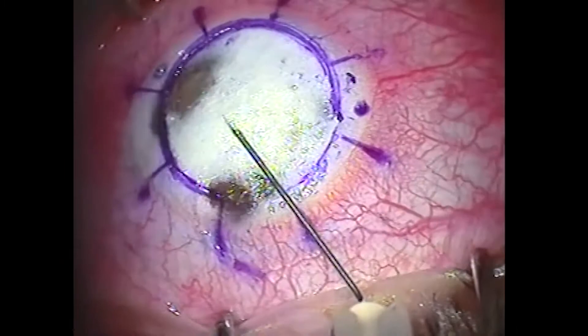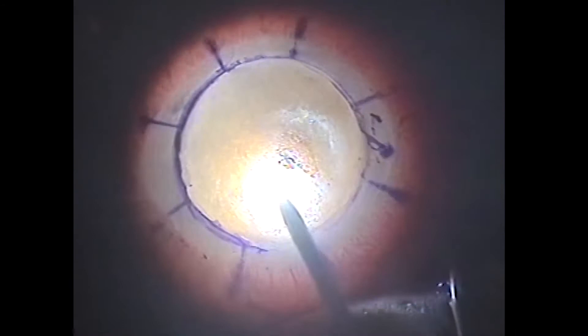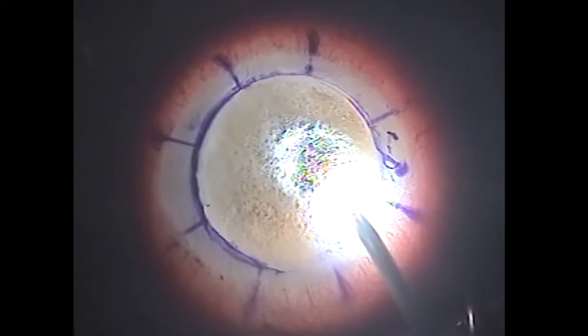Here we can see a small decentered bubble. We proceed to apply more air to expand it. We recommend using this technique on every single DALK.